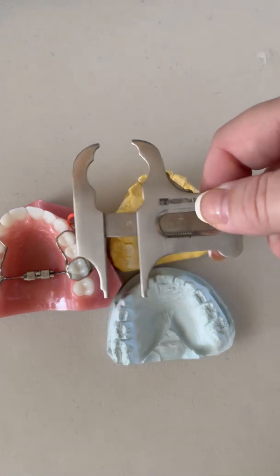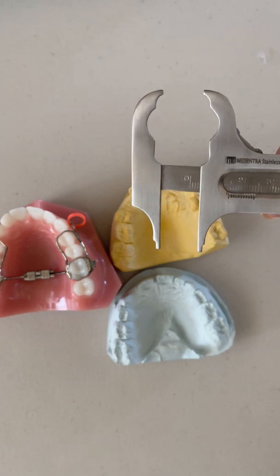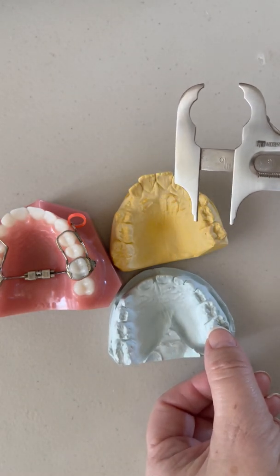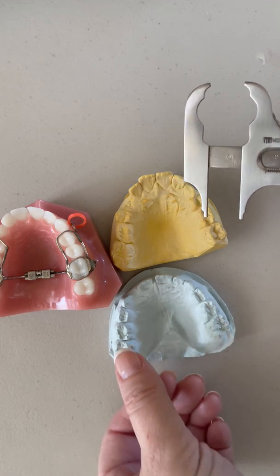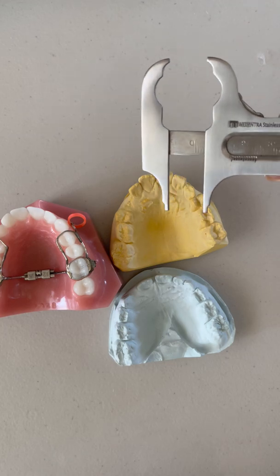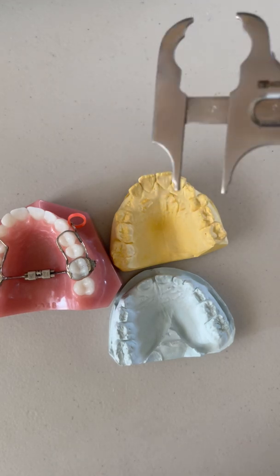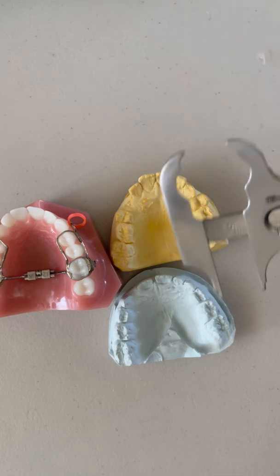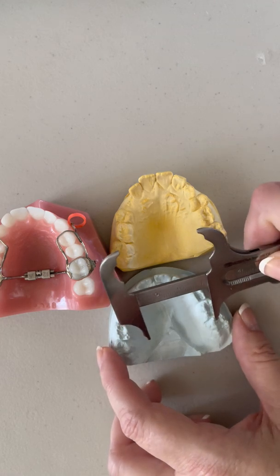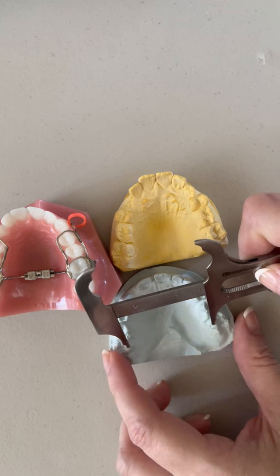When I use a Boley gauge — I like them because they can be autoclaved — if you don't have one, you can take a little piece of floss, stretch it across from cusp tip to cusp tip, trim it, and measure it against an iPhone measuring device. You can also just take the number off a scanner if you have one. So going mesial palatal cusp tip to mesial palatal cusp tip — this to this.